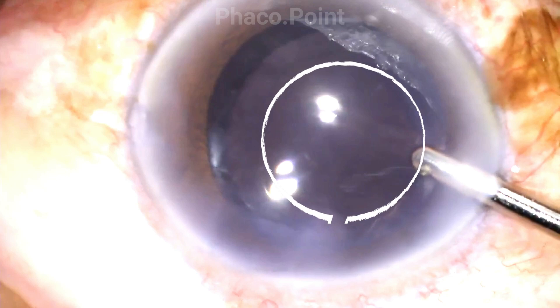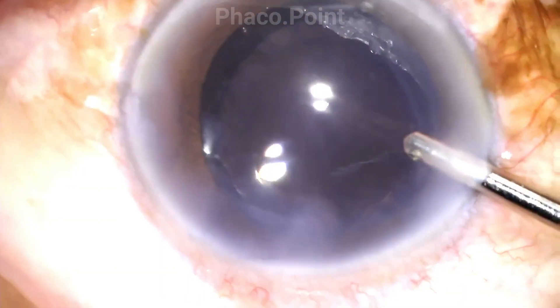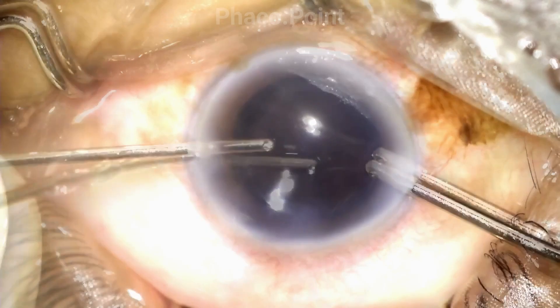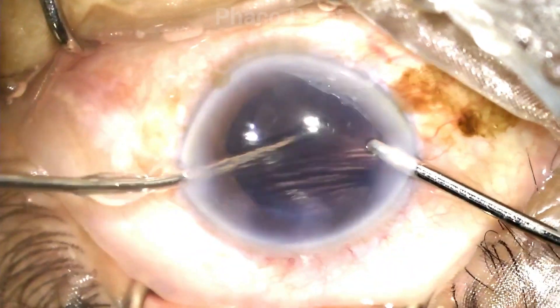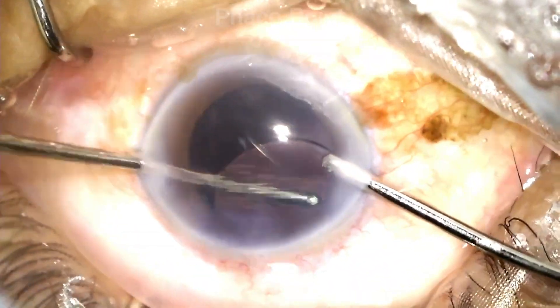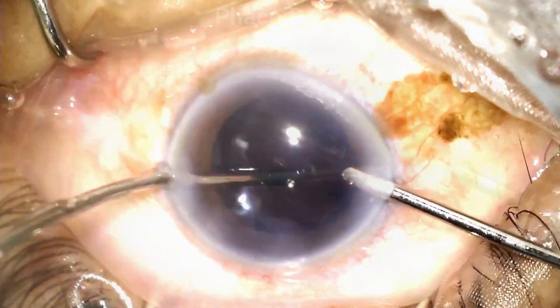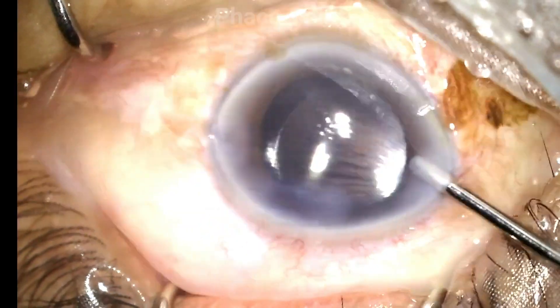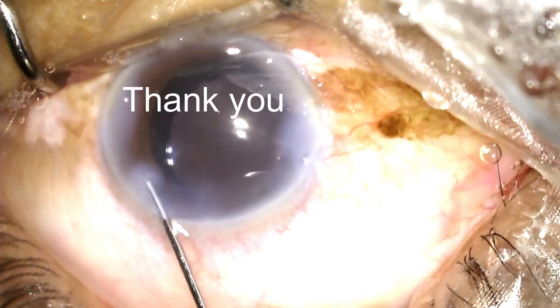A quick point to note is that I have enlarged the capsulorexis under irrigation, though you could very well choose to do this under viscoelastic as well. We now proceed to performing the visco wash, where all the viscoelastic from within the anterior chamber and behind the IOL is carefully and completely removed. Finally, the hydration of the wounds brings us to the end of this case. Thank you.